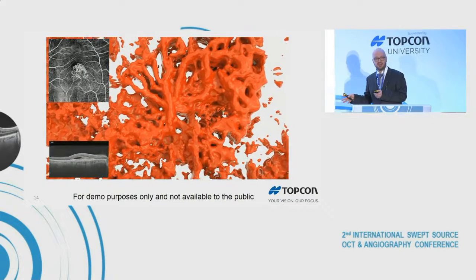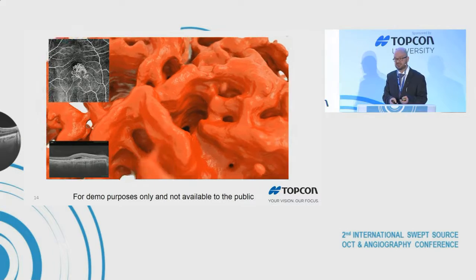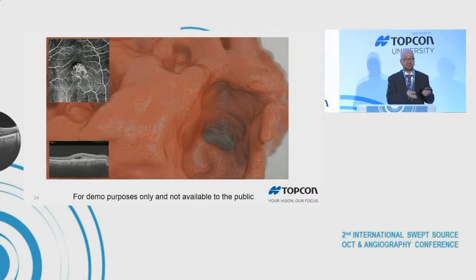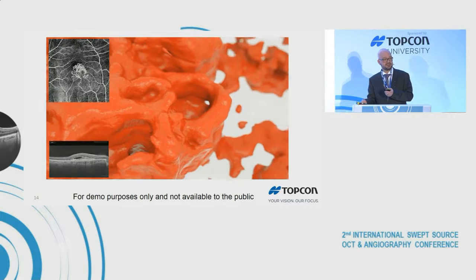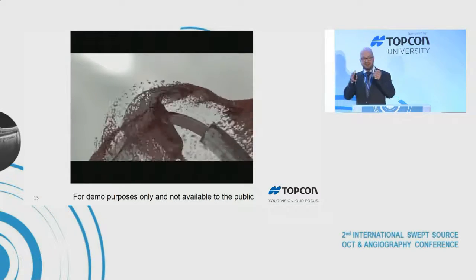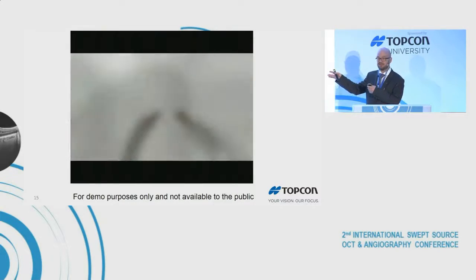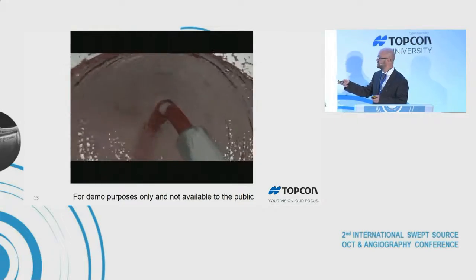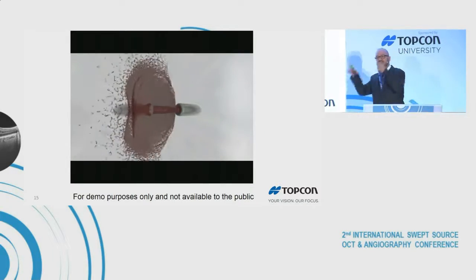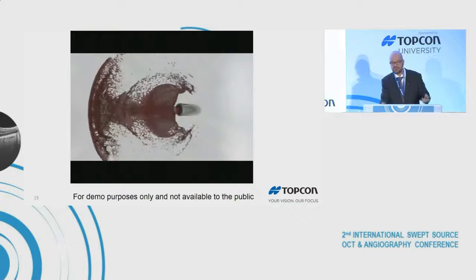So I created this. This takes that data and segments it into triangle mesh segmentation, so it actually creates a real structure in the virtual world that can then be used for fluid dynamic simulations and a volumetric analysis to see what's going on with the structures. So I took that information and I combined it with something else I was playing with. As you can see, I like playing with my PC. And here you see a fluid dynamic simulation of blood that I created just to see if I could do it. Now, if you take that fluid simulation of blood and you mix it with the triangle mesh simulations, I wanted to see if we could get this to interact directly with the segmentations I got of a real patient.